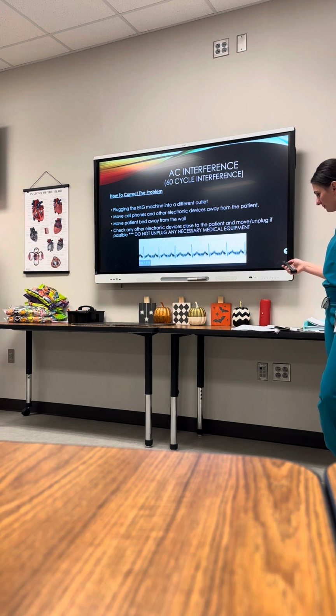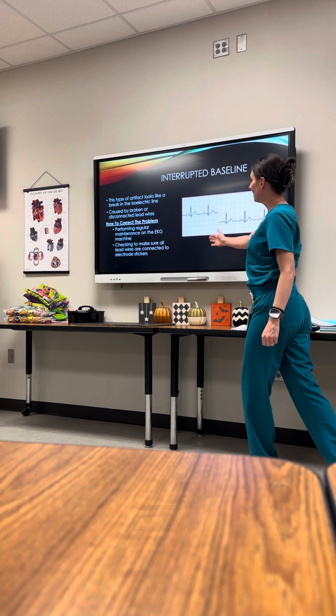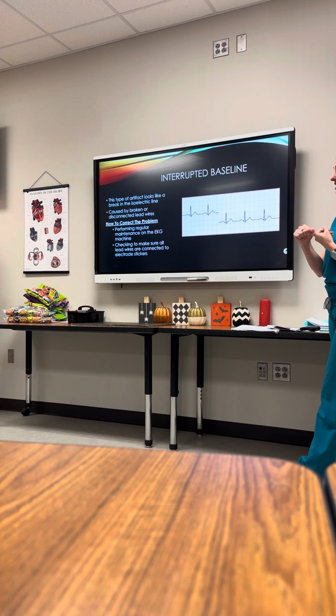Let's go to the last one. The last one is interrupted baseline. This is artifact that looks like a break in the isoelectric line. It's caused by broken or disconnected lead wires. How do we correct it? Perform regular maintenance on your EKG machines and check to make sure that all lead wires are connected to the electrode stickers. Okay?